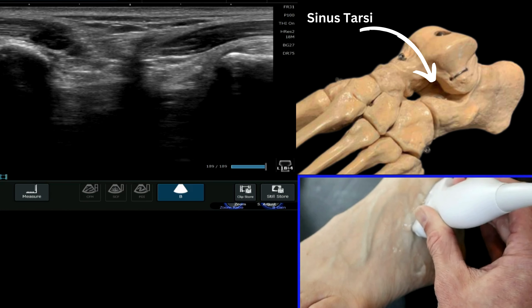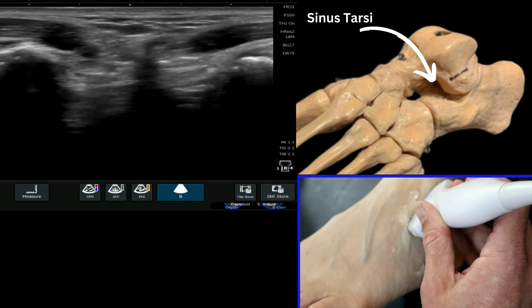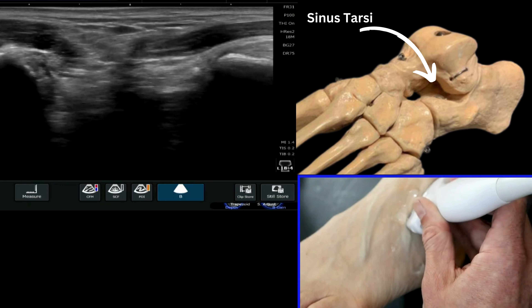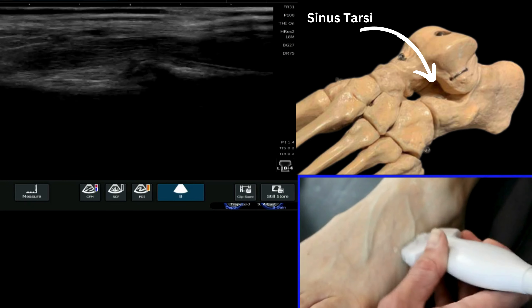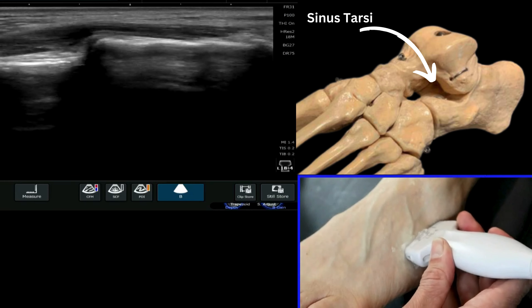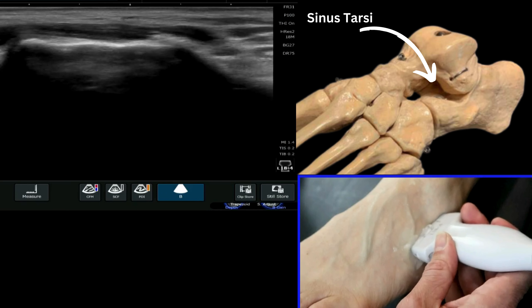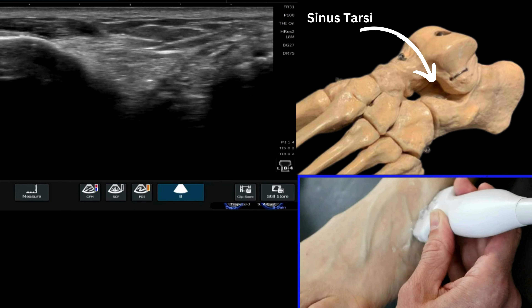Just take note of the angle that the probe is at — it's quite a steep angle to generate this image. It's important, as we just said, to start off initially identifying that calcaneus at the calcaneo-cuboid joint and then just roll your probe up proximal, keeping the calcaneus on the left of the image.